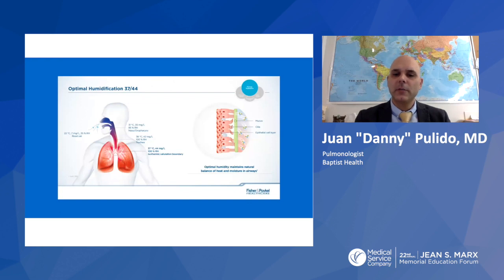Now, leading to the humidification effect. As I mentioned earlier, with the nasal passages, the heated nasal airflow, if used without humidification, will drastically irritate the nasal passages and lead to risk of bleeding in the nasal passages. But with the humidification effect, the bleeding has since been eliminated or minimized. So that is a beneficial feature that high flow offers.